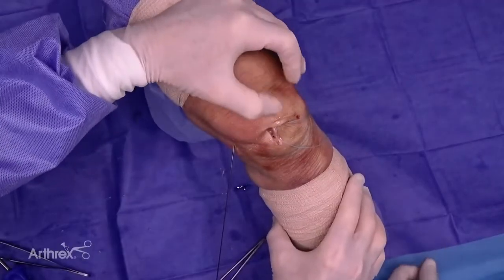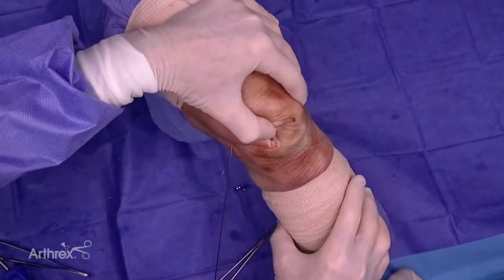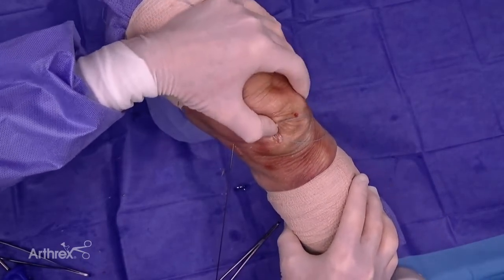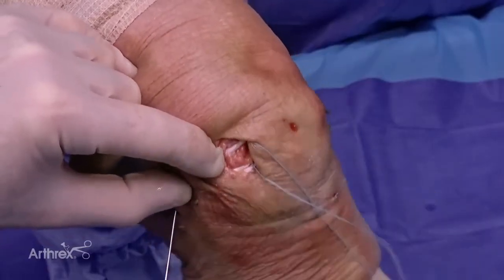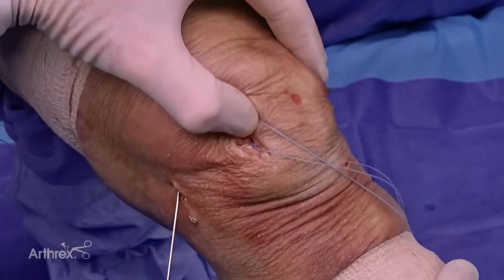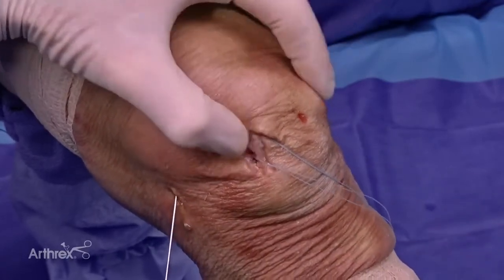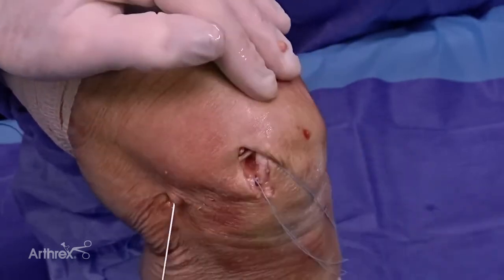Now checking the patella — I have these two sutures I use to close the medial retinacular tissue. The patella is stable with good mobility. It's important not to over-tension it. Here's our stability check: two limbs of the graft, full range of motion, good fixation but not overly tight — just right. There may be a little movement toward full extension, but stressing at 20 degrees the patella is totally stable. Nice movement in the groove, no skipping, no jumping — completed MPFL.